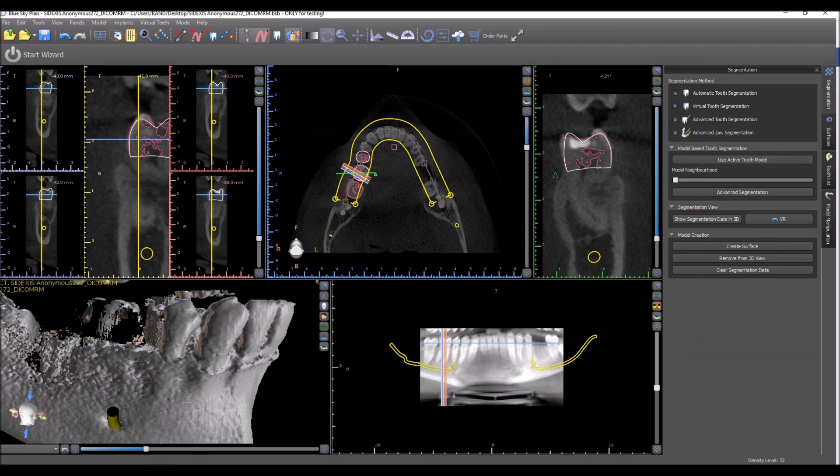For a more exact extraction, we could use advanced tooth segmentation, which takes a little bit longer, but we're going to discuss that in a different video.